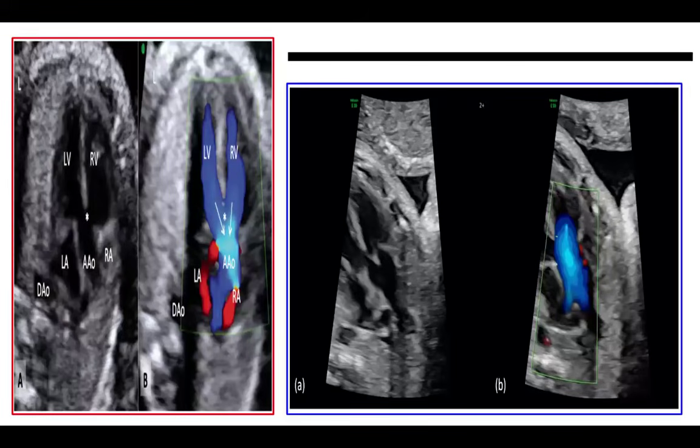So now when we look at this, we can tell the differences here, especially in the blue box, we have one common trunk of a vessel. We see where there is that thickened truncal valve. Okay. Yes, there's a VSD. We do see the VSD present here, but you can clearly see the differences and know that this is truncus or common arterial trunk versus the tetralogy in this case.